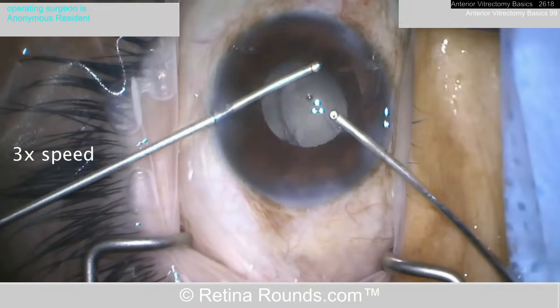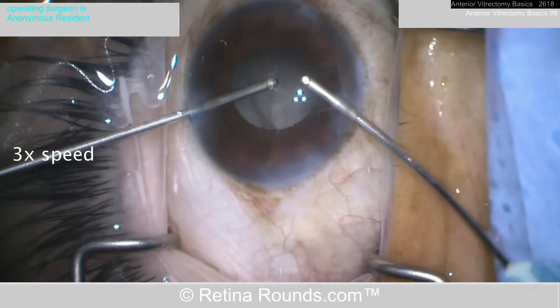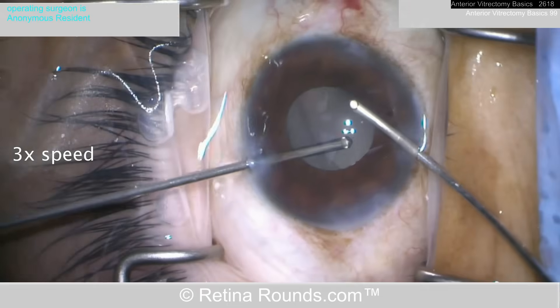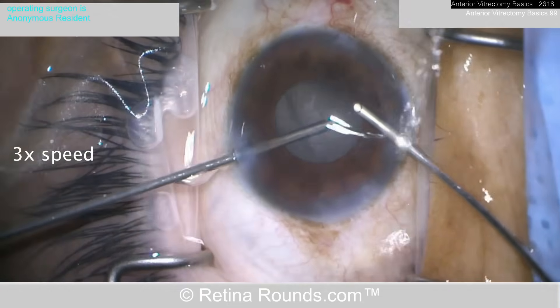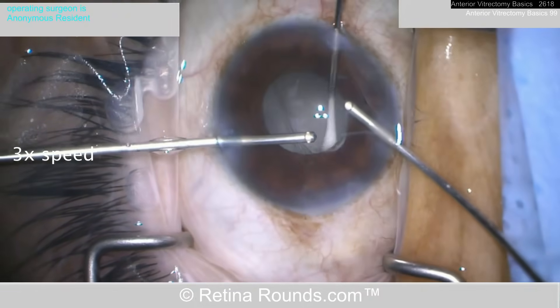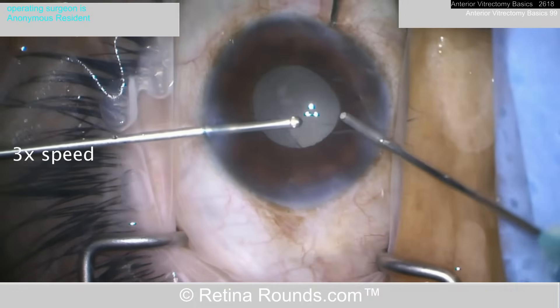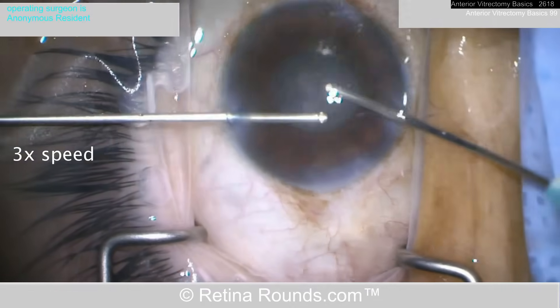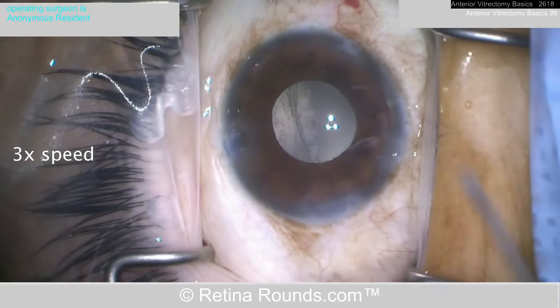The handpieces have been reversed — the cutter is now on the left and the irrigation handpiece on the right — and more vitreous is being cleaned out. Keeping the cutter mouth up and slowly going around to remove any residual vitreous. It's looking significantly improved, with a lot less vitreous than at the beginning.